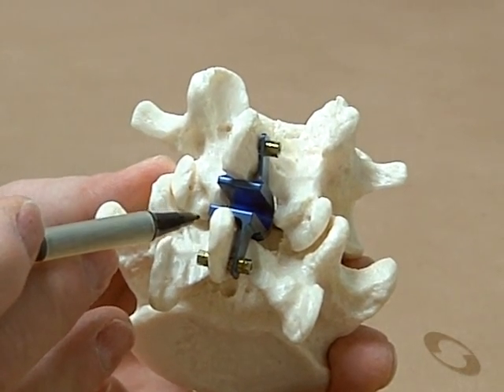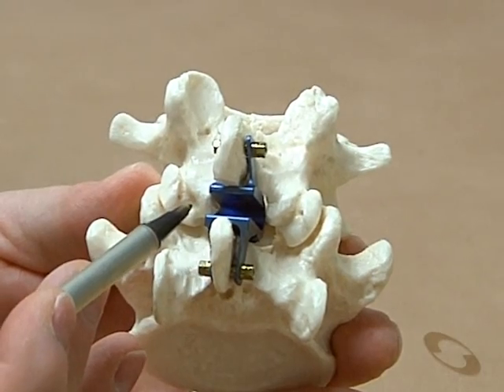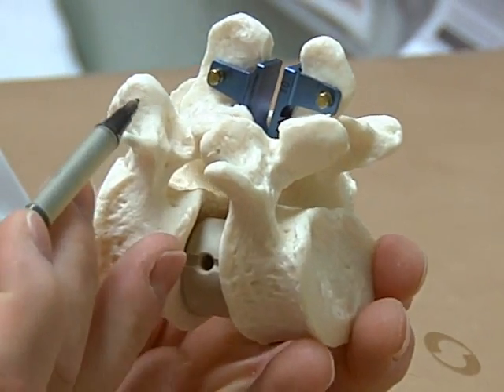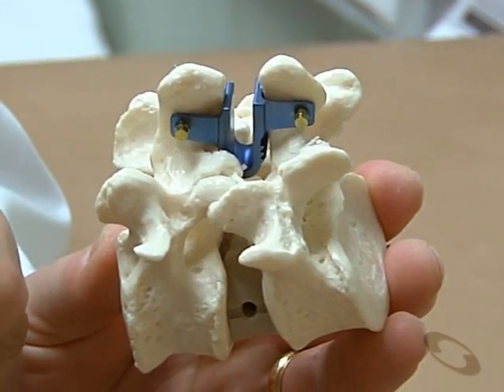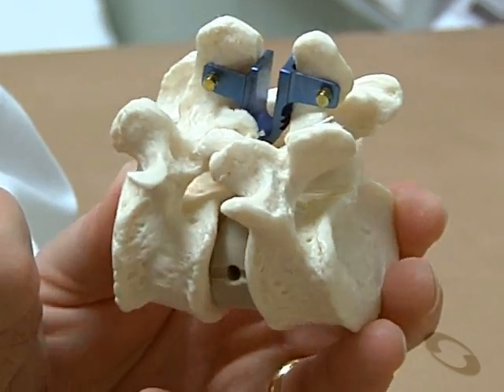To stabilize the posterior spine, we're going to insert an implant called the coflex-F, and this is an example of that implant. It's a curved titanium implant, and this implant is intended to be placed down so that the curve is deep down within 1 millimeter of the dura or the nerve canal.